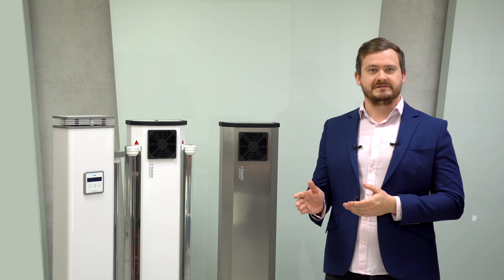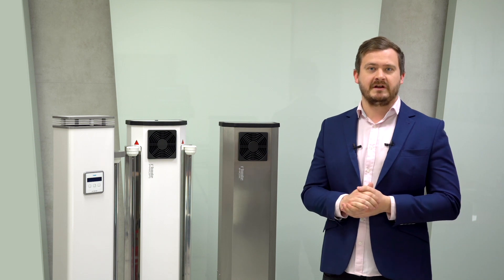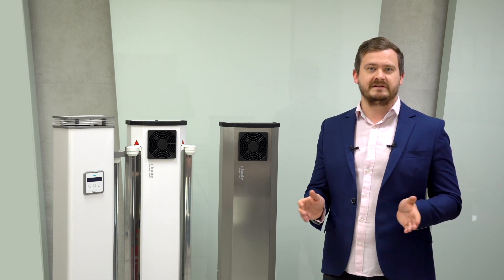Elite is a product for professionals who value the highest quality and aesthetics. Modern design makes Elite sterilizers suitable for any room, whether a doctor's practice, office, or apartment. The little brother of Elite is the room version, which has a smaller housing and shorter compact radiators. Room is designed for living rooms, bedrooms, and hospital rooms, but can also be used in commercial, office, and public premises with an area of up to 50 meters squared.